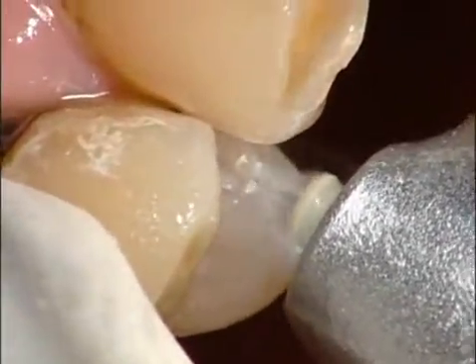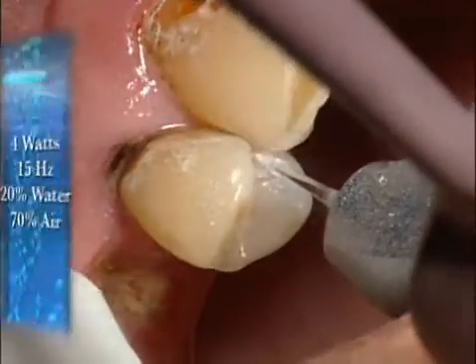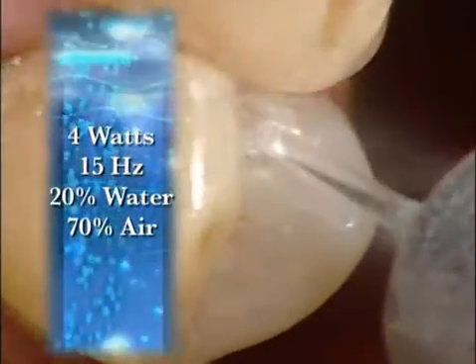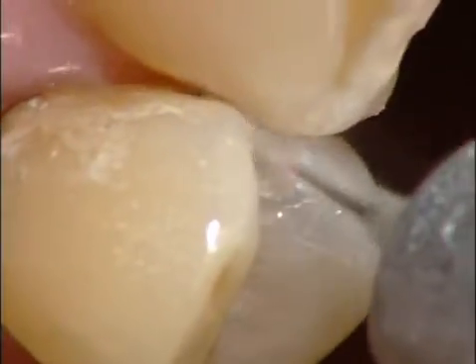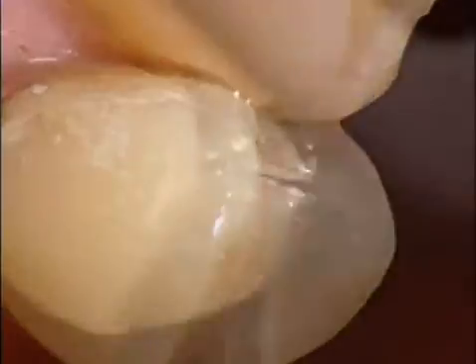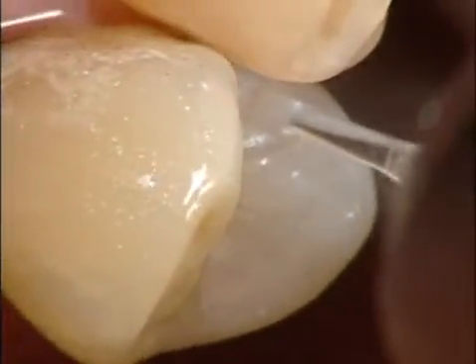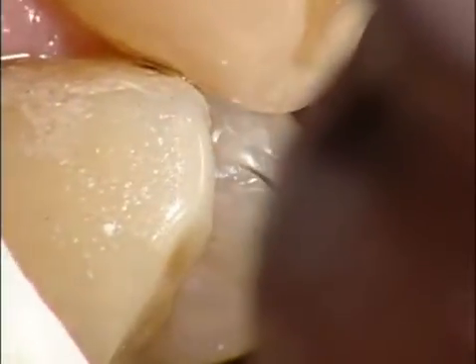Remembering, if the patient becomes sensitive, it's very simple to just press a button. This is a preset I have in my laser: 4 watts, 15 hertz, 20% water, 70% air. I find that after using 1 or 2 or 3 different laser anesthetic techniques, 95% of the time I can do the procedure with minimal to no patient discomfort.